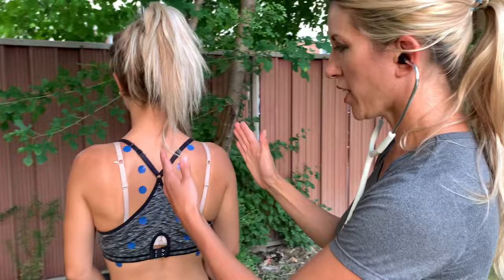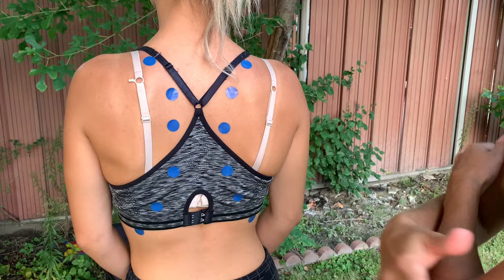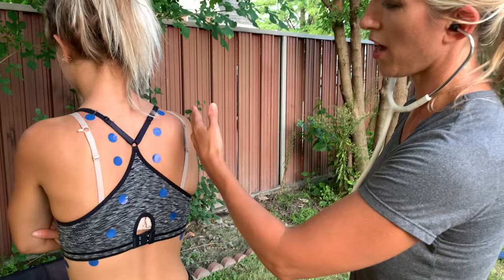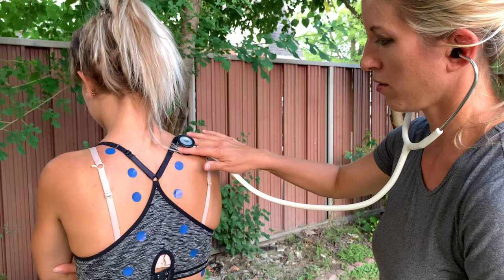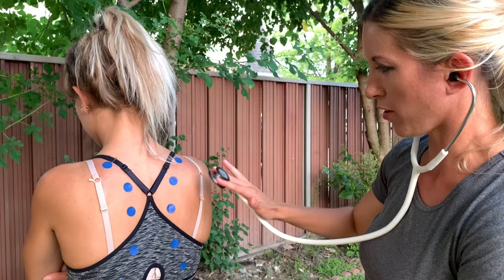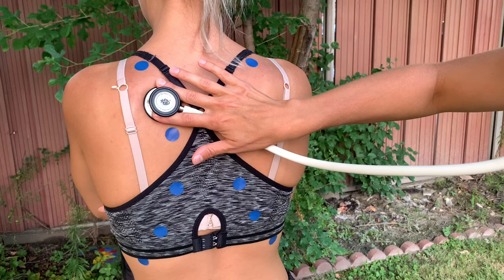Now turn around. All the marked spots are where you're going to listen. You want to listen in between the scapula. A trick to help open up the scapula is to have the patient cross their arms and lean forward a little bit — that helps spread the scapula apart. You should ideally place the stethoscope right on the skin. Listen one side to the other and go down in a ladder fashion, listening for a full breath in and out at each landmark.